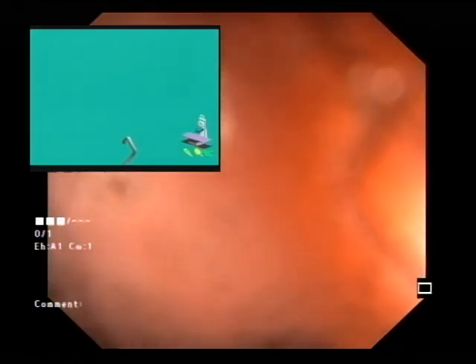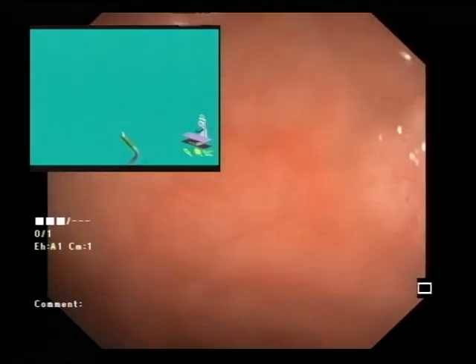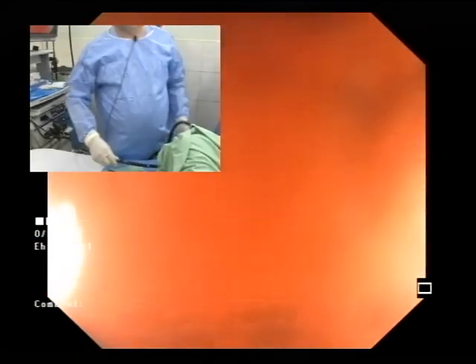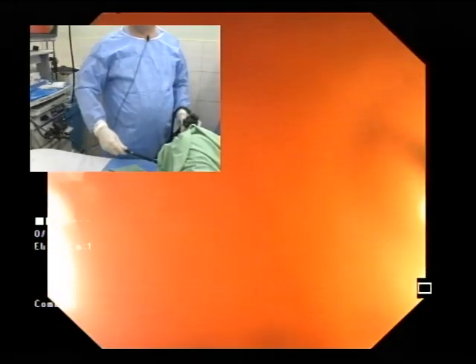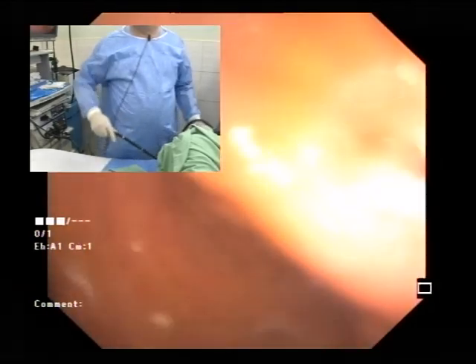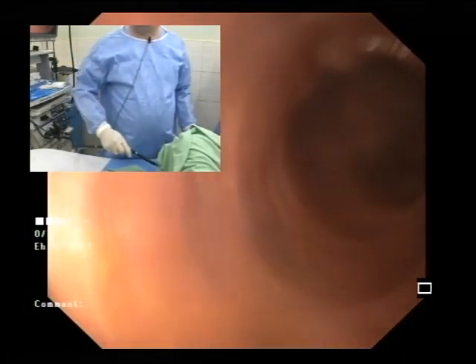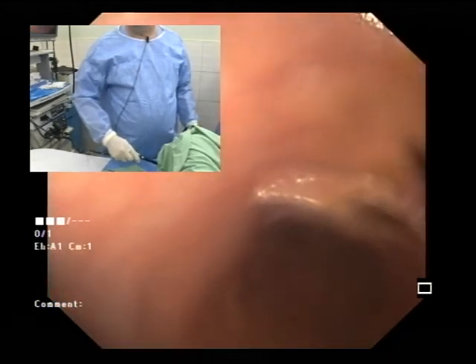give a real-time image. What you've got is a perception of depth by the density of the grey colour. Where it's lighter, it's actually further away, so that means it's going posteriorly to the dish that's receiving the image. I don't know if you can see the dish itself. Now, if you notice there, I did an anti-clockwise and then drew back. So each time I go around the bend, I then advance and then I draw back.